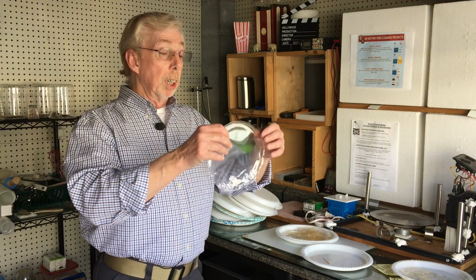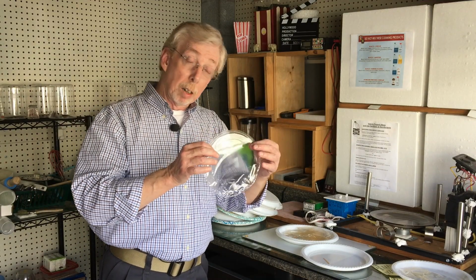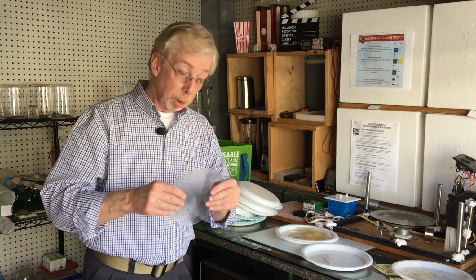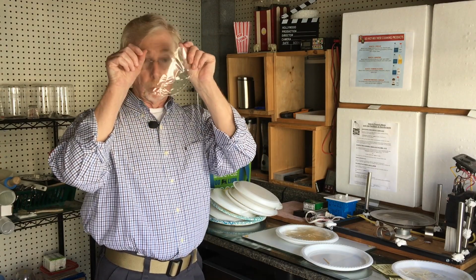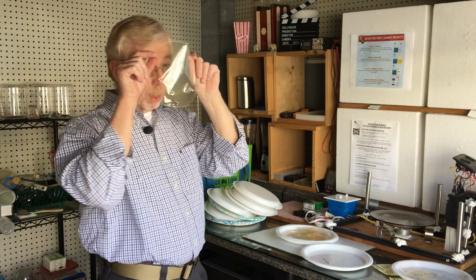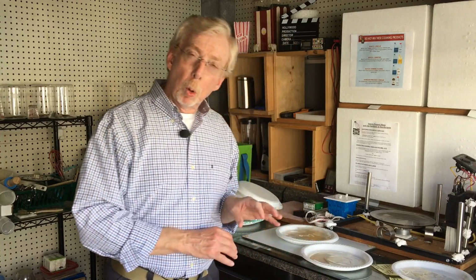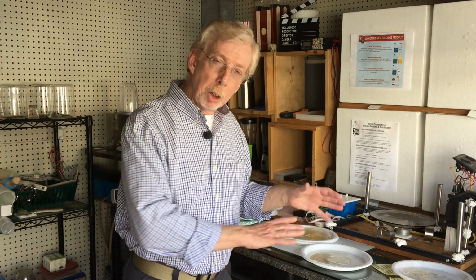The addition of the glycerin has taken out a lot of the bumpiness. It's much more flexible, and this is where we want to be for something like a face shield, I would think. And of course, the bubbles. You can still see those. And it's an important point to continue here, but in another video.